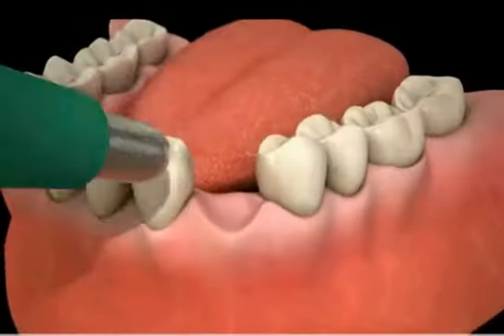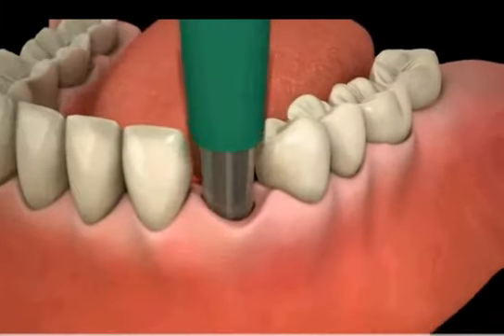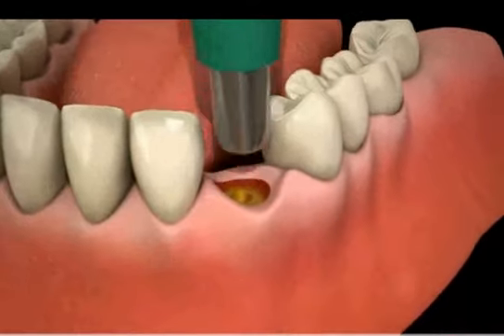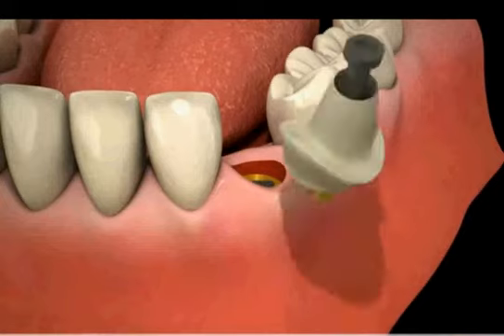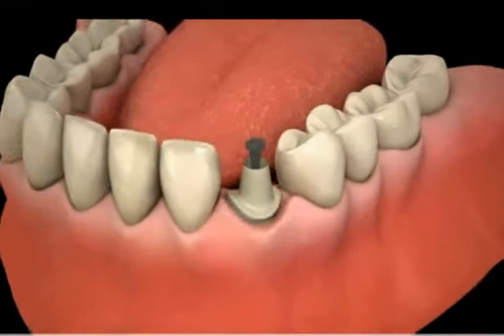Once healed, the tissue covering the implant is removed. The screw is removed and a post is then attached to the implant with a small screw. At this time, another x-ray may be required for verification.